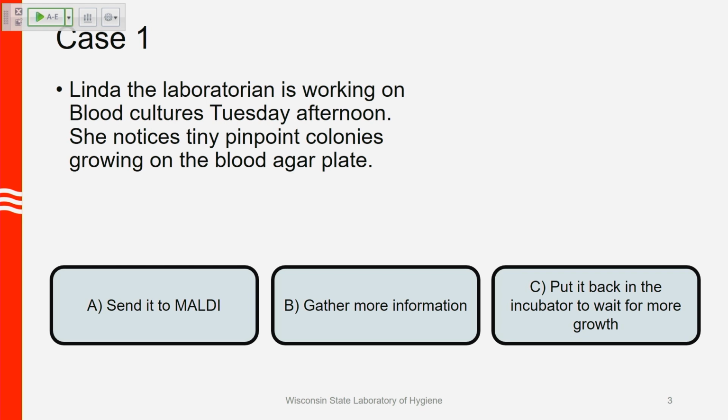So in my first case, Linda, the laboratorian, is working on blood cultures Tuesday afternoon. She notices tiny pinpoint colonies growing on a blood agar plate. Should she A, send it to MALDI, B, gather more information, or C, put it back in the incubator to wait for more growth?